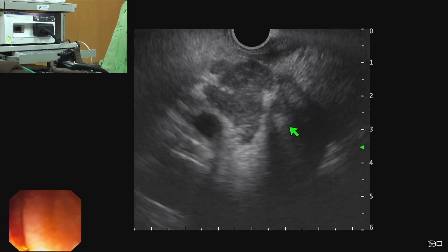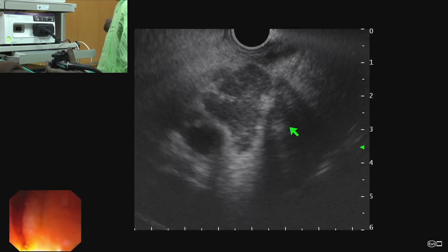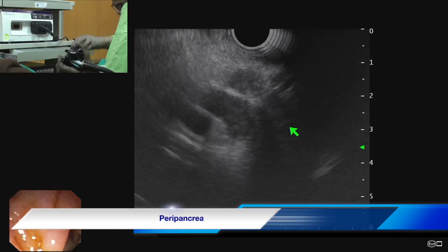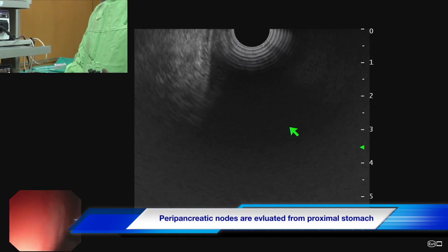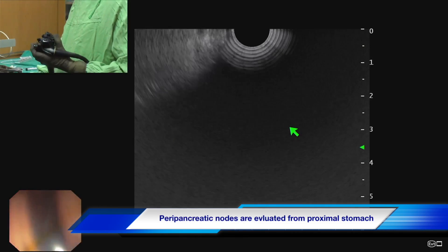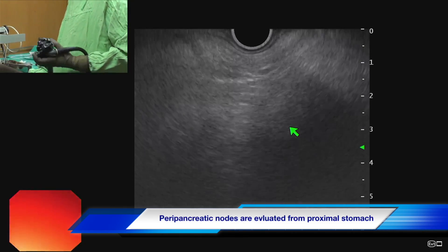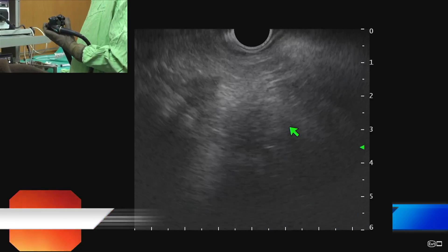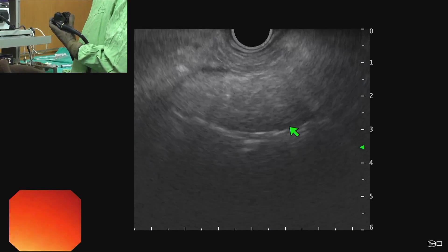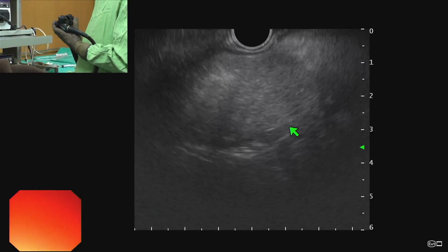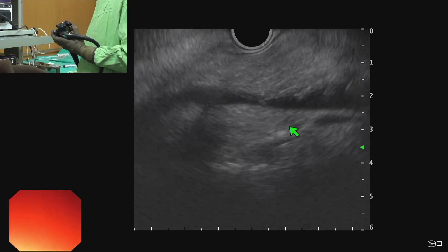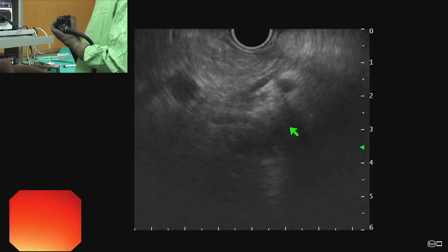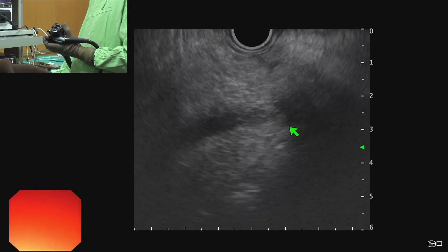Next is evaluation of peripancreatic nodes, which is done from the proximal stomach. The trick is first to localize the portal vein, and when we see the portal vein we can localize the pancreatic head and pancreatic body. Here we can see the pancreatic body.